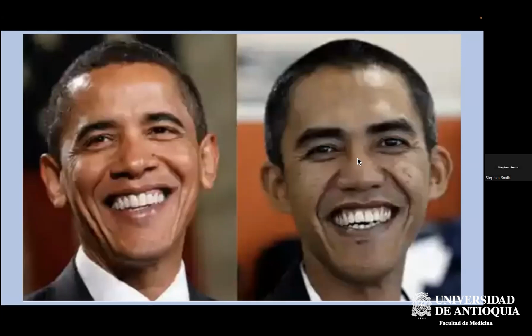And the other thing, so I told them, we have to use artificial intelligence. Looking at an EKG is like looking at a face to me, and I can recognize that face like artificial intelligence. The other thing I told this group is that you have to be able to digitize images. There are so many images available which an artificial intelligence system can learn from if it knows which is OMI and which is not OMI. But in order to do that, it has to take an image and make it into a digital file which can be analyzed by AI.